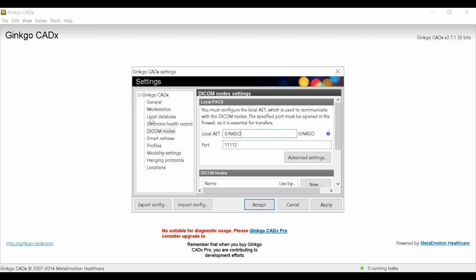Okay, so we're going to go ahead and keep this name simple. Remember, I changed my port. We're going to give it a port. Now, I want to tell you about ports. Why didn't I give it the same port as the server?